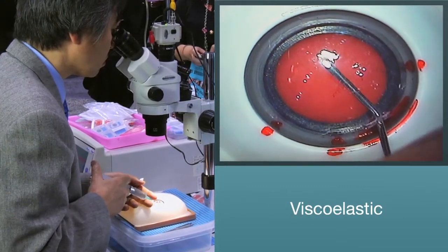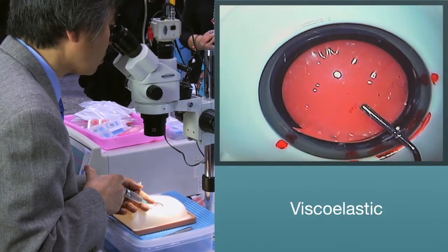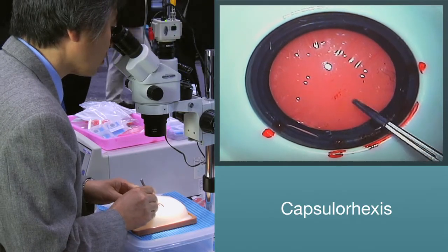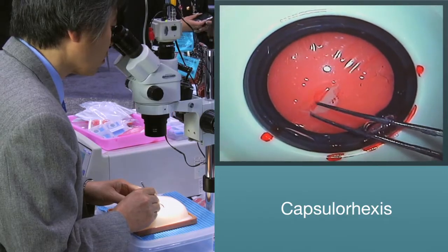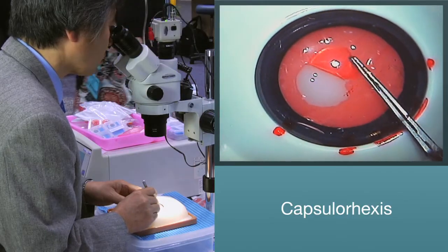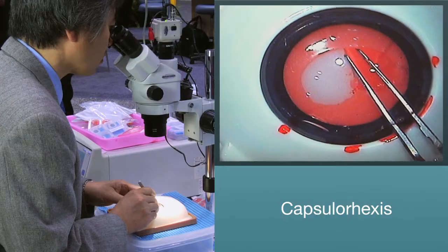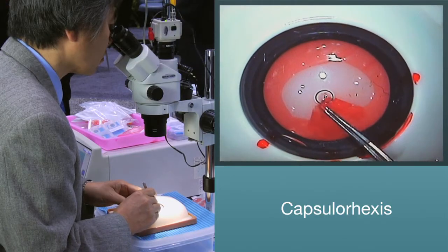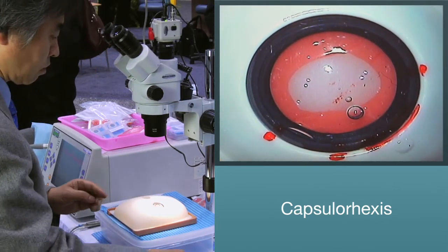Fill the anterior chamber with viscoelastic. Now that the eye is prepared, the surgeon will make the capsulorhexis. You will have a choice of making the initial flap with a provided cystiotome, or you may choose to use the Kataro capsulorhexis forceps to make the initial flap and then continue on with the remainder of the all-important surgical technique. The Kataro anterior capsule film provides a realistic feel of the human capsular bag.